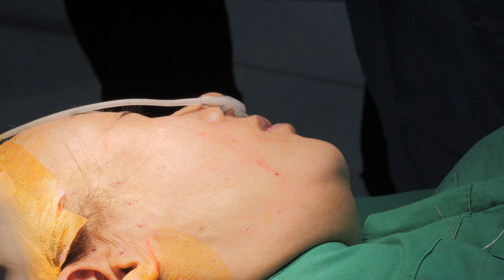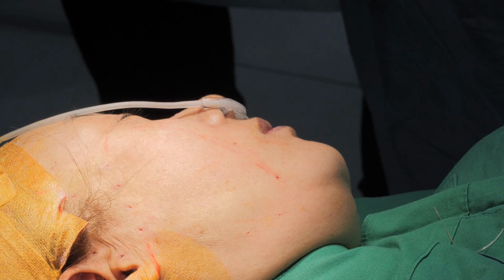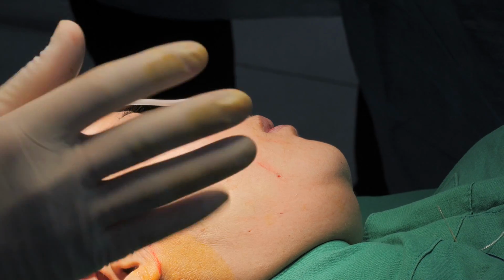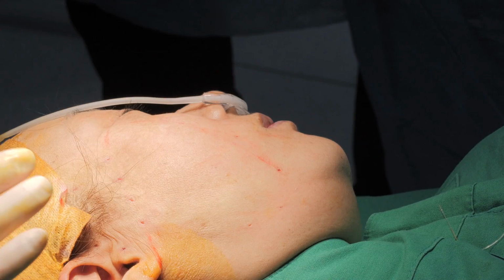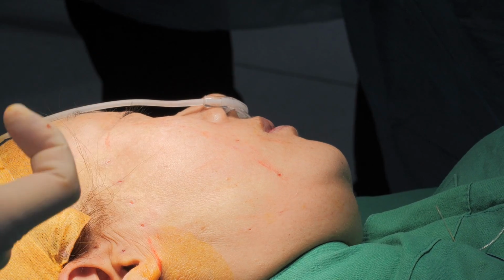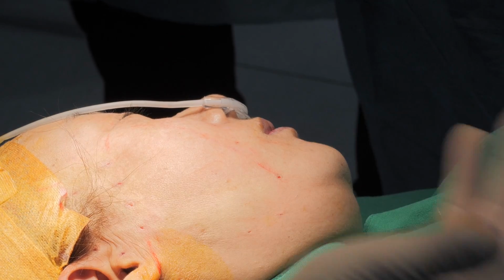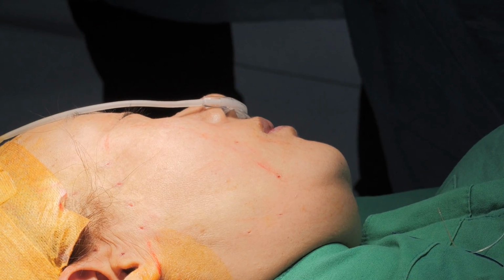For me, I applied some lifting laser before the procedure, but it's less invasive. Nothing changed. But after that, I apply thread directly on that day. I can also inject filler. I can also apply HIFU before the thread lifting on that day. Why not?